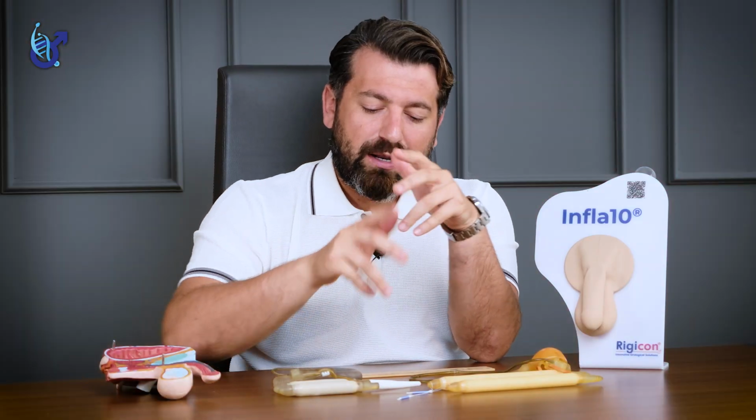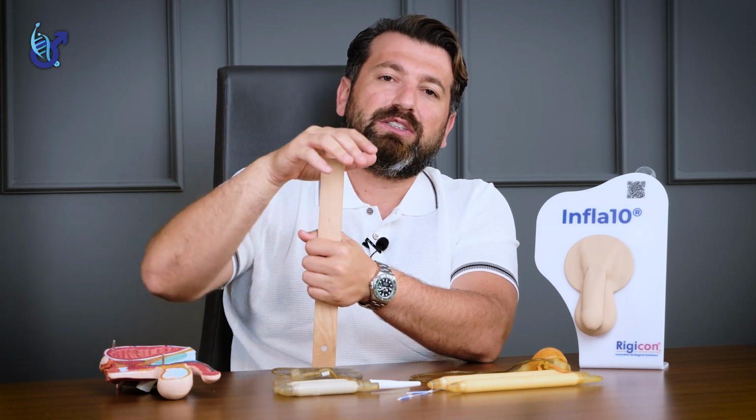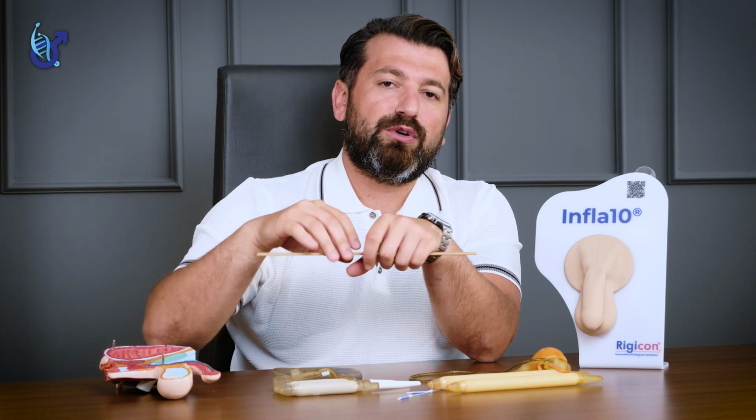When I put my hand on his penis and forced it, I saw that the penis was bending too much. And I asked him how many centimeters of rear tip extenders were used for him. When we checked his surgical reports and guarantee card, we saw that he used 5 centimeters of rear tip extender and 15 centimeters of corporeal body. Let's talk about details in penile implant surgery.